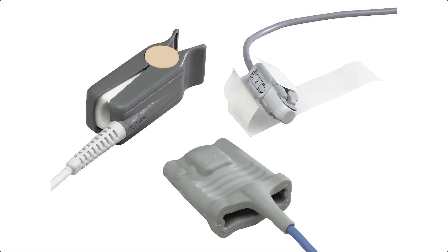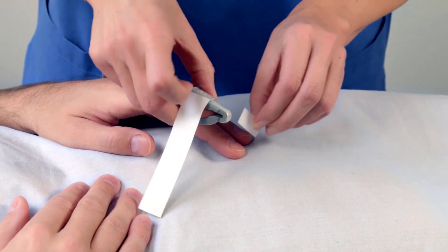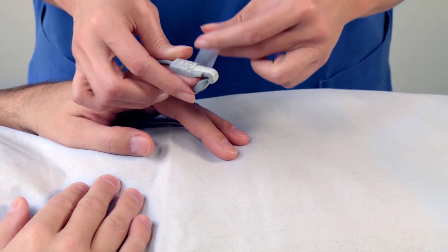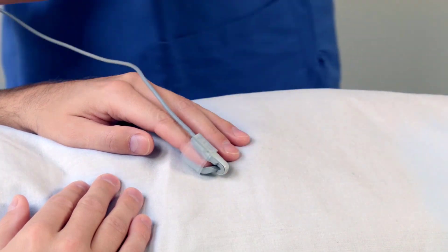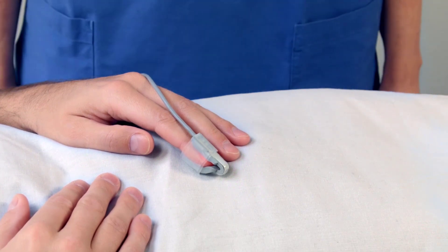To measure SpO2, select a good extremity and consider different sensor types. The application site should match the sensor size so that the sensor can neither fall off nor apply excessive pressure. Check that the light emitter and photodetector are directly opposite each other. All light from the emitter must pass through the patient's tissue.